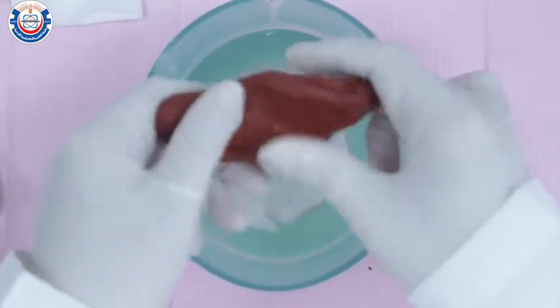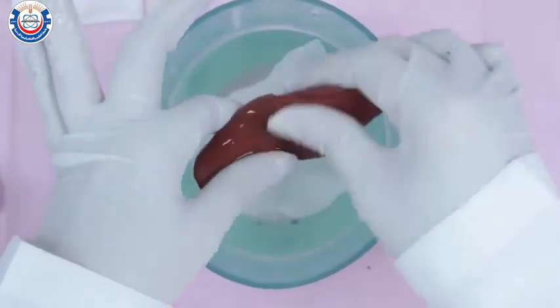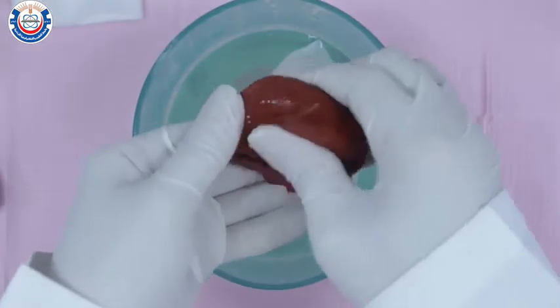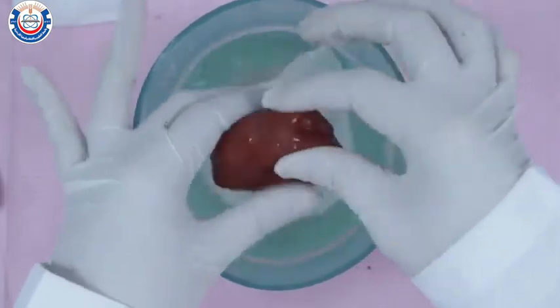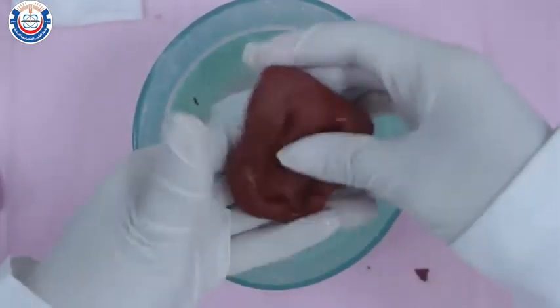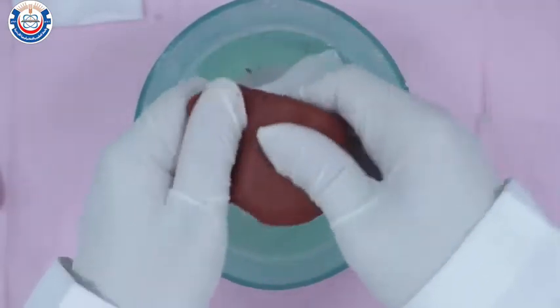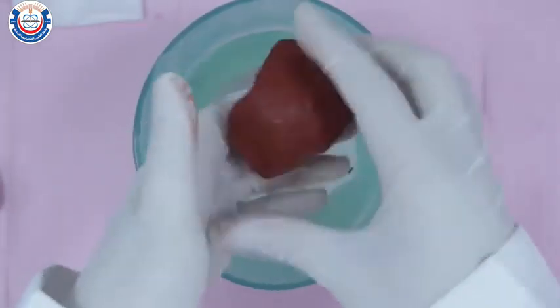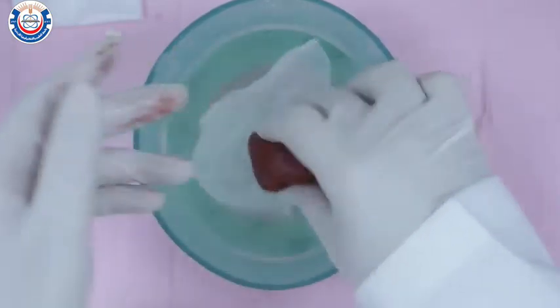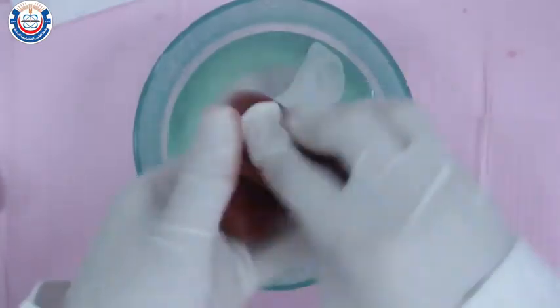The material should be uniformly soft as you place it inside the tray. Avoid prolonged immersion or overheating, because this can result in low molecular weight ingredients leaching out from the compound, leading to increased brittleness or a grainy mass. Knead the material between your fingertips until it's completely softened to a plastic state. If it's sticking to your gloves, you may use Vaseline to aid the process and give a smoother surface. Remember that the material has very low thermal conductivity, so adequate time should be allowed to obtain thorough heating.